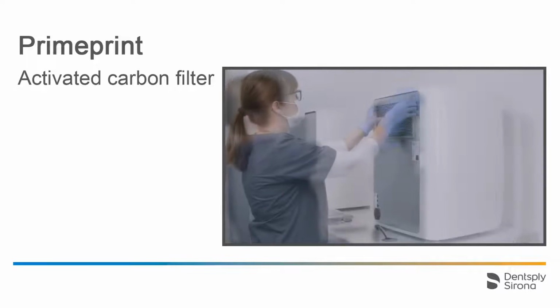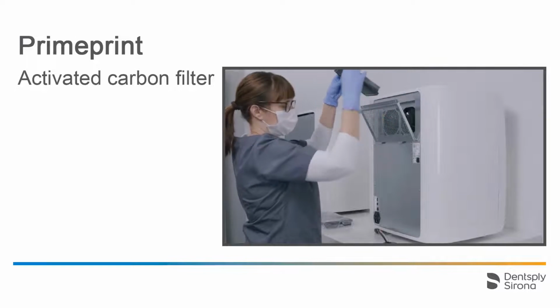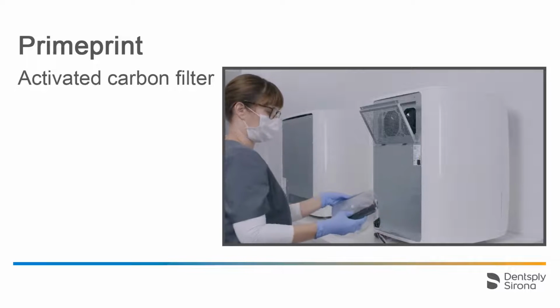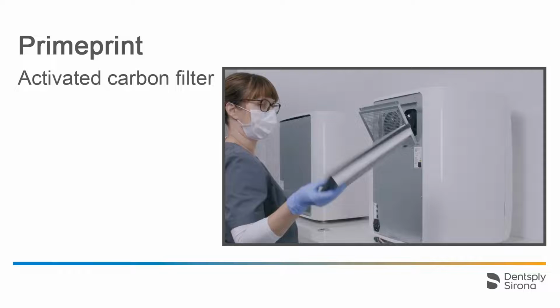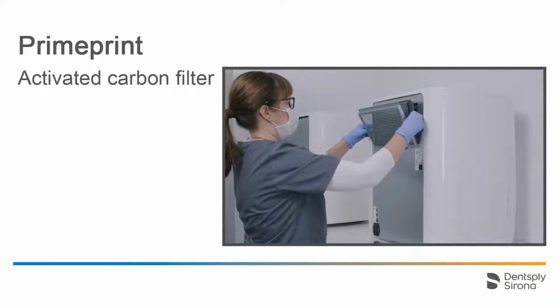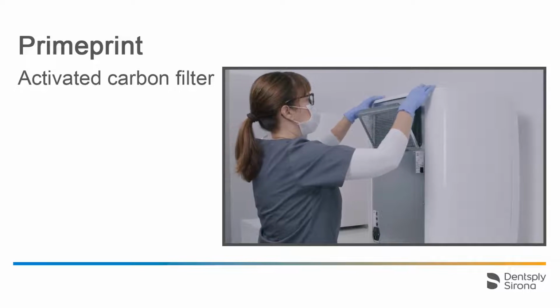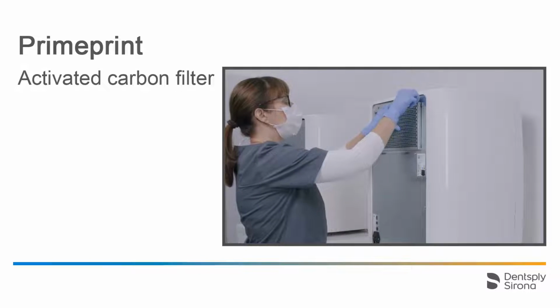We remove the two knurled screws of the perforated plate and dispose of the filter according to country-specific regulations. Then we insert a new filter, making sure it is properly seated. Next, we fasten the perforated sheet with the knurled screws again.